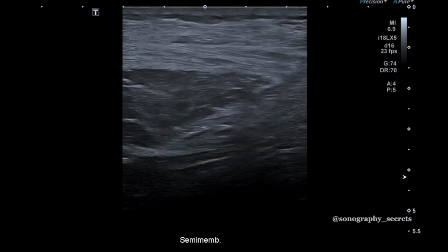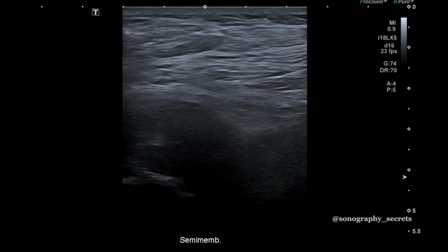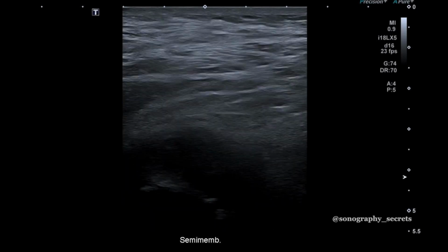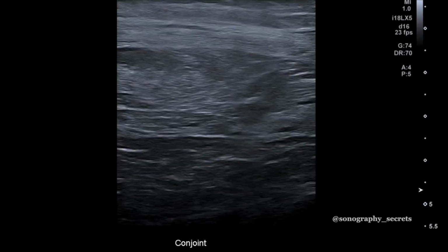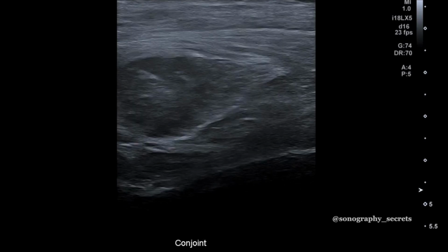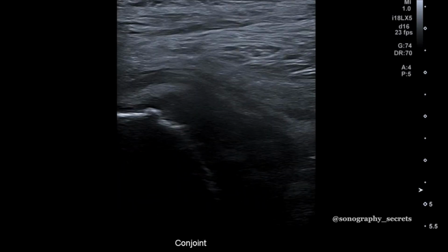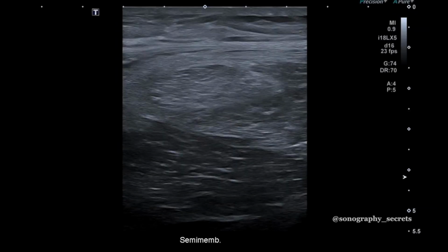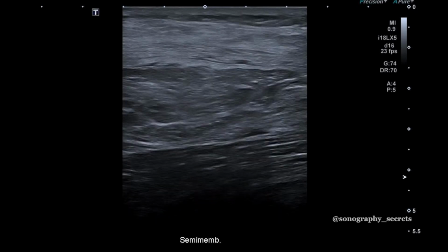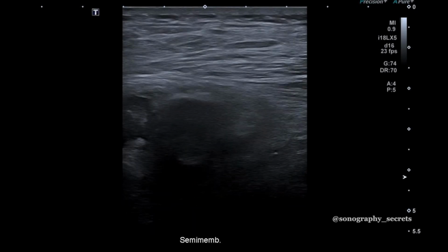Sometimes we get this sort of appearance. So this was a 60-year-old lady who slipped on some wet tiles. So basically she did the splits when she doesn't normally do the splits. So again, I'm thinking free tear. So these can be really difficult, these injuries. You'll note with this scan that we've got quite a lot of echogenic fat and we've got some fatty replaced glute max. So when you have that, then these scans are going to be pretty difficult.